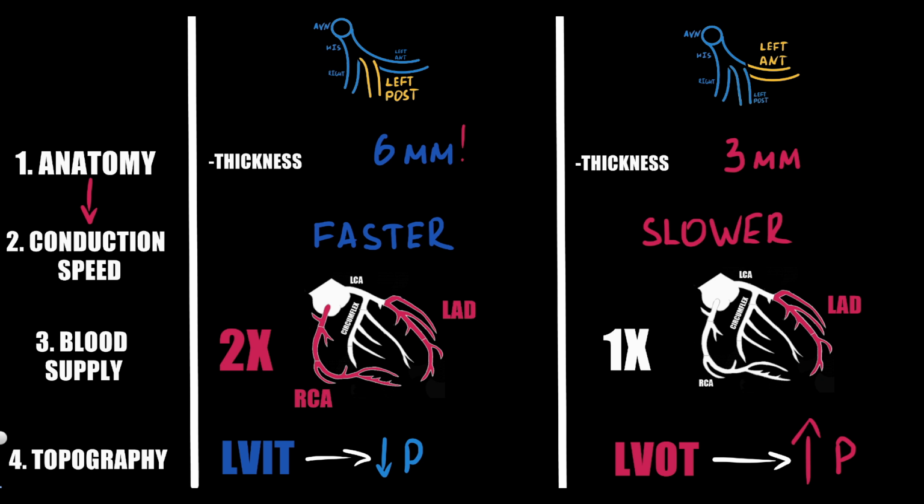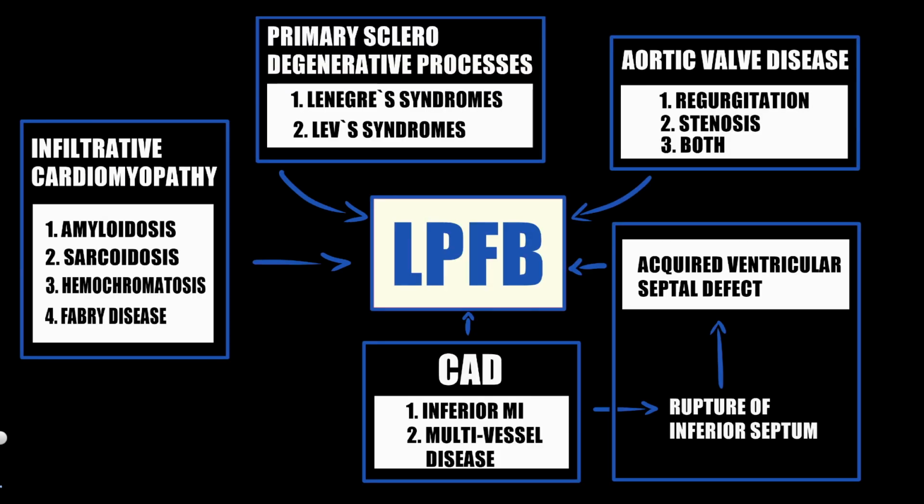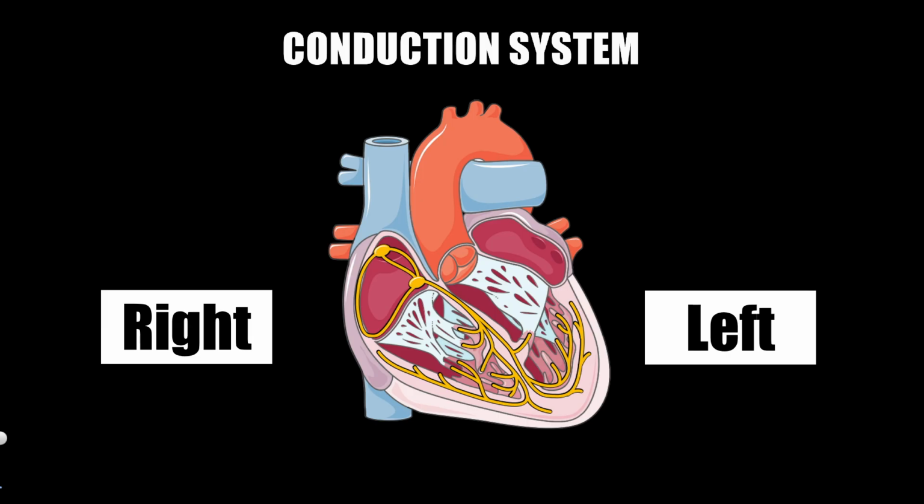And at the end of the video, we describe the rarity of left posterior fascicular block related to the differential diagnosis algorithm, and finally, etiological factors. You can use the time codes to check the most relevant information for you.